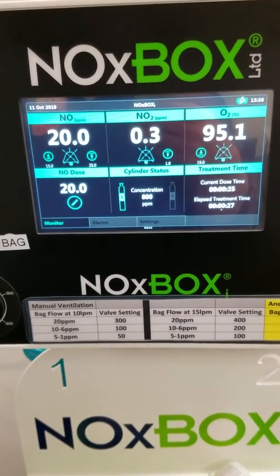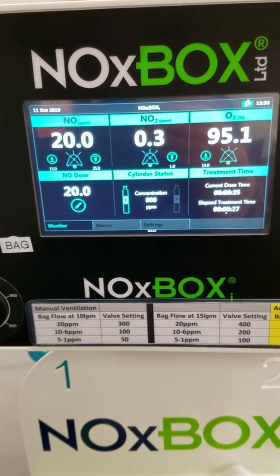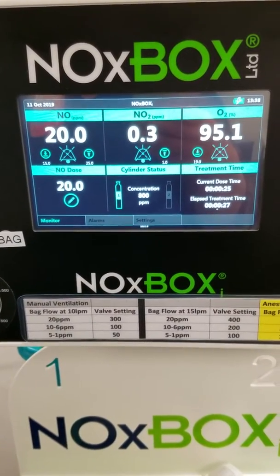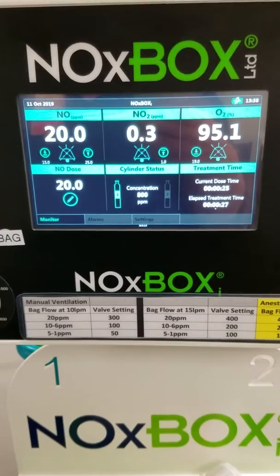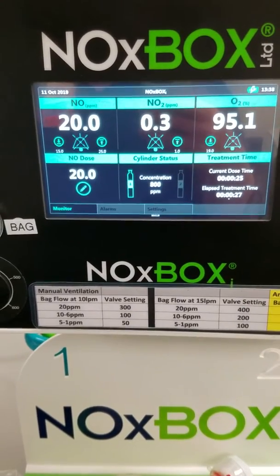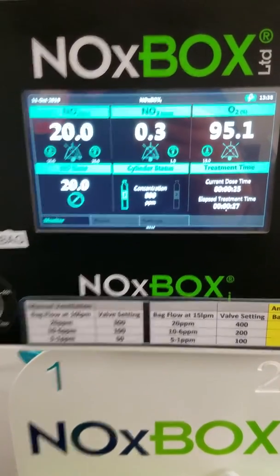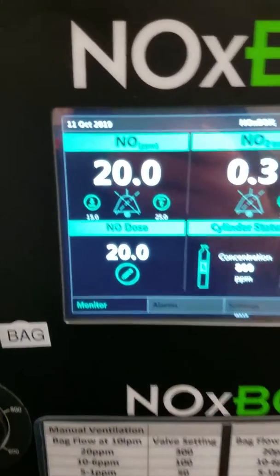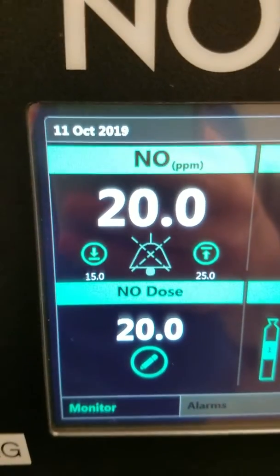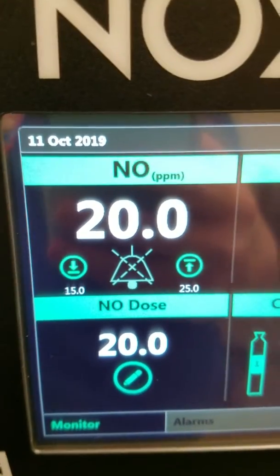We're now going to manually ventilate our patient using the NoxBox nitric delivery system. It's a three-step process. The first is your iNO parts per million — we're delivering 20 parts per million.